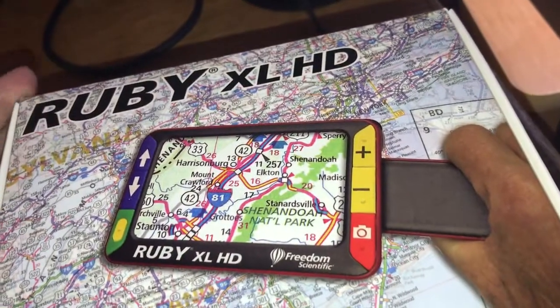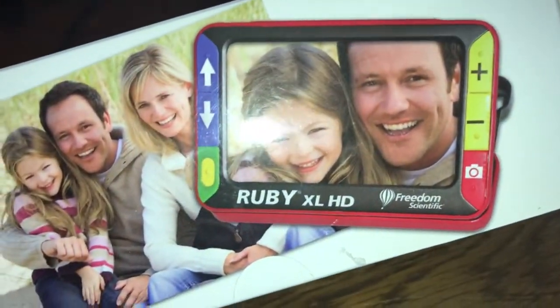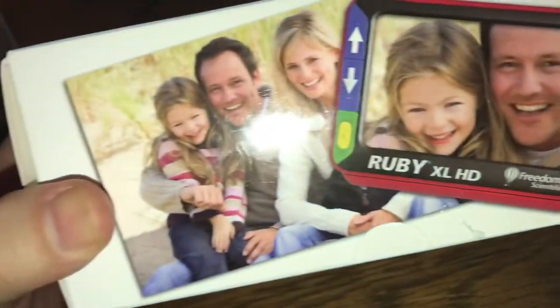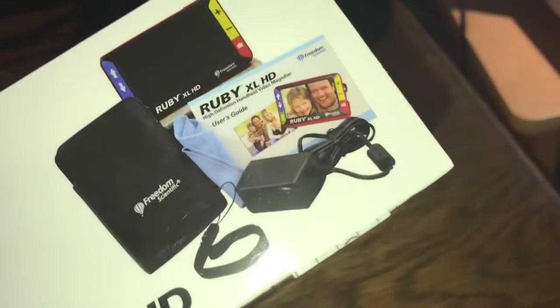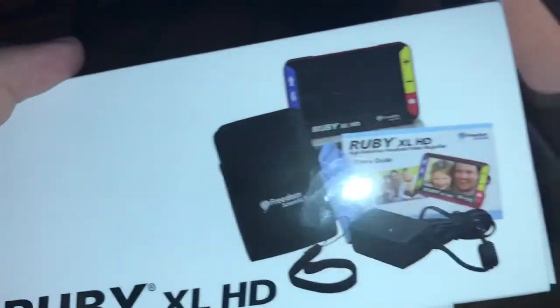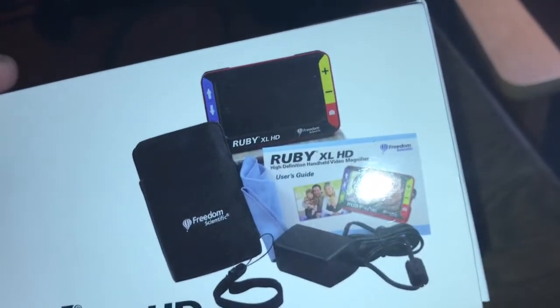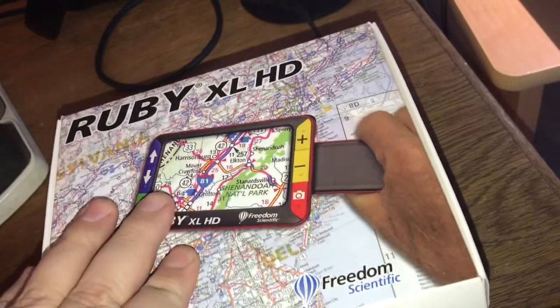This is a 5-inch screen. This is actually a Freedom Scientific product. I really do like some of the Freedom Scientific low vision stuff. The Rubys have for many years actually been a very good CCTV.